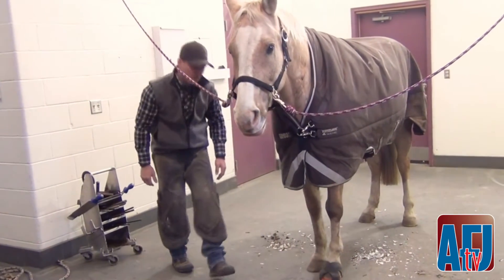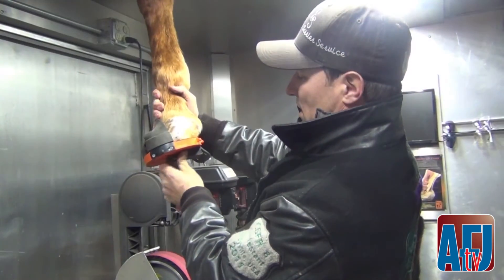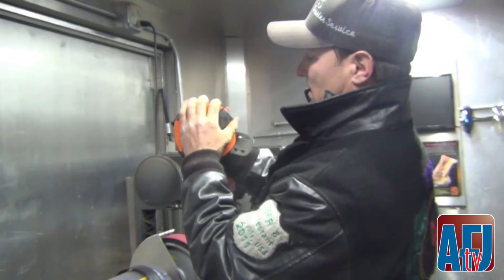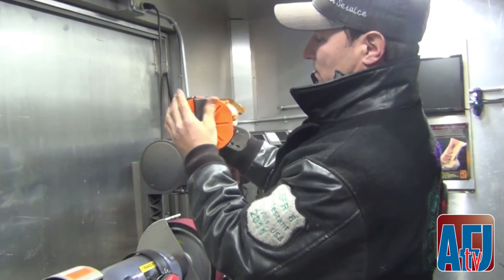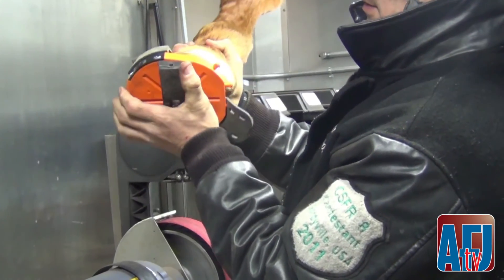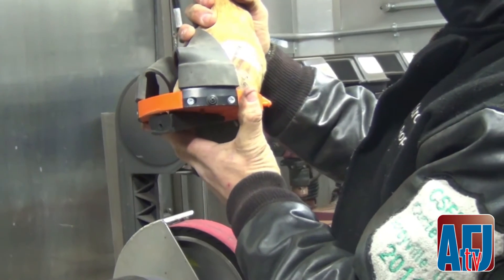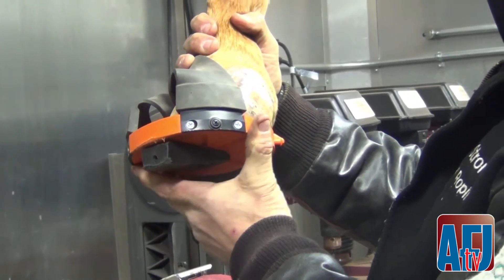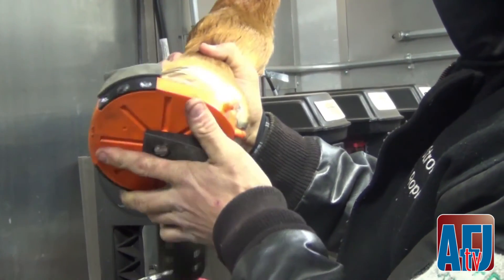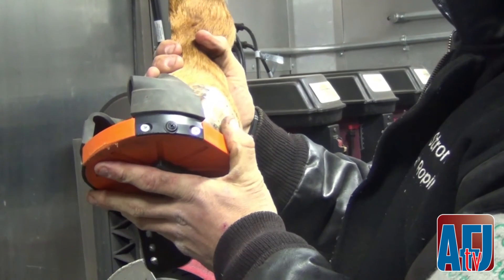When it's strapped on the foot, we can change the angle just with an easy click. We have eight different positions — you can raise the outside, you can find out if you need to wedge the back part of the foot or increase the angle in the toe. So, let's go.